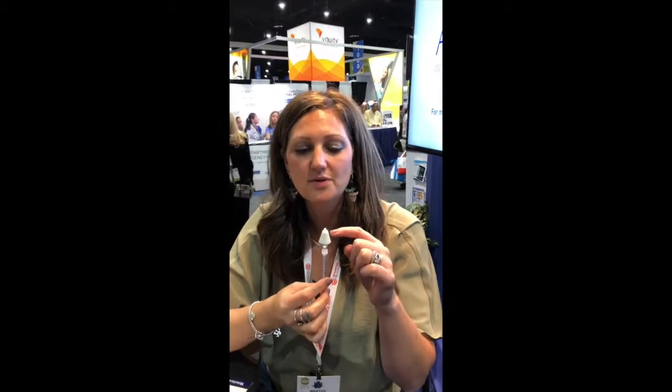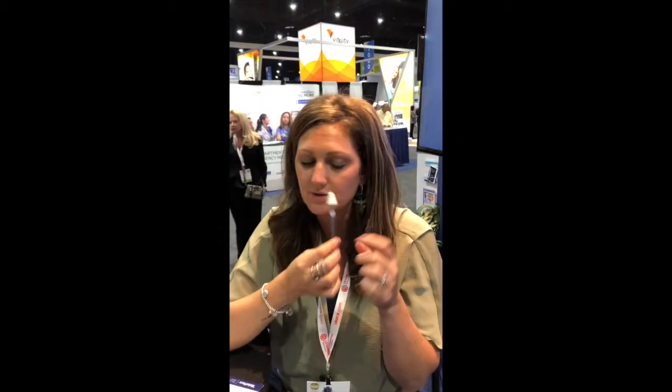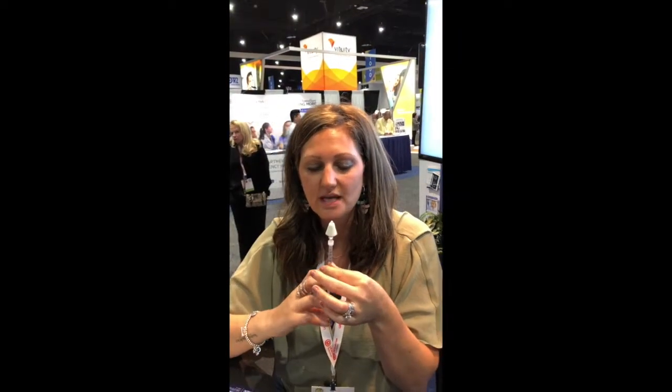One of the key points to using an atomizer is not to stick it into the nose straight up. You don't want to hit the septum. You don't want to go too high in. You just want to put the little tiny pointy plug here inside the nose and then tilt it a little bit outward so that you're actually hitting the mucosa on the outside of the nose, not the septum.